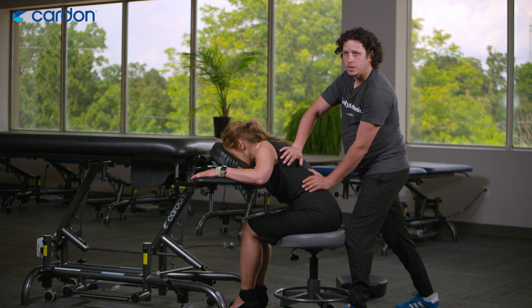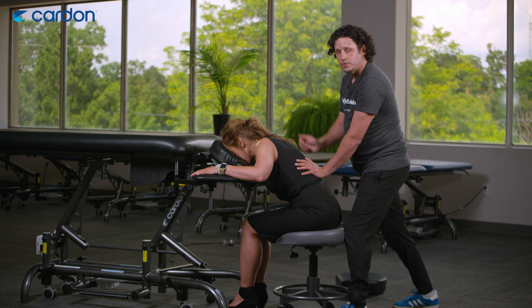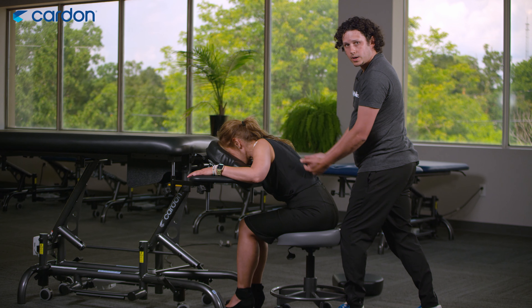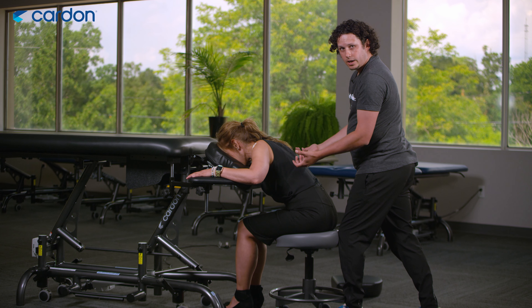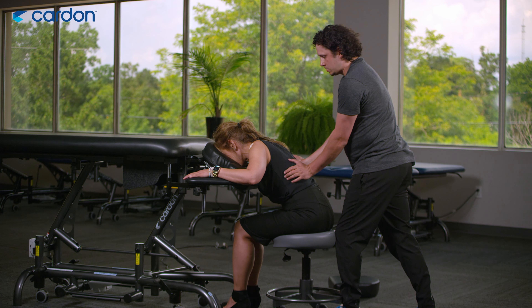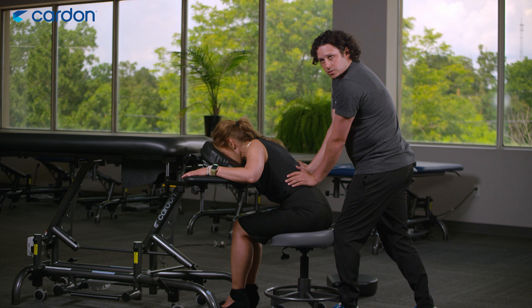I can still do all my treatment work with my patient in the seated position, still using the full benefit of the table. And if a client is wearing a nice work outfit like we're demonstrating now, it doesn't create the crinkles on the clothing — the client can go back to work during their lunch hour without looking like they got a massage treatment.